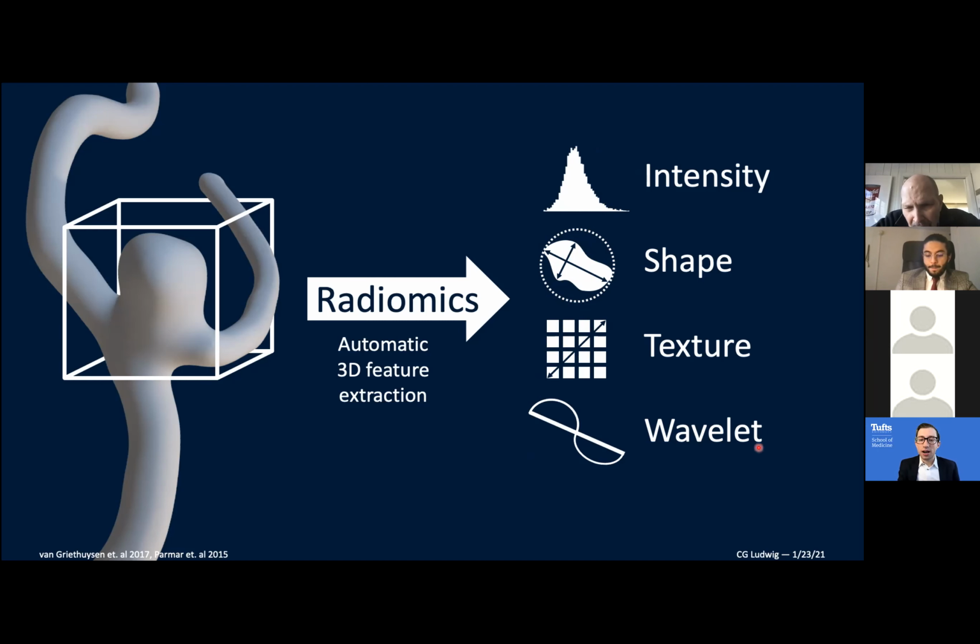And radiomics, these features have been evaluated in really a variety of medical imaging contexts, including some that I found were differentiating between glioblastoma and anaplastic oligodendroglioma, 2 primary brain cancers, also classifying different subtypes of lung cancer based on histological specimens. And then even I found assessing the degree of liver fibrosis from elastography, which represents a non-invasive option to assess for the degree of fibrosis in folks with liver pathology.